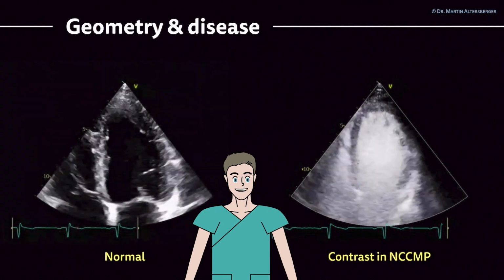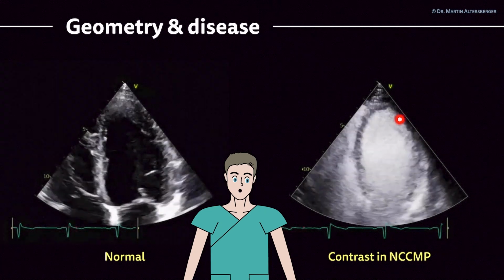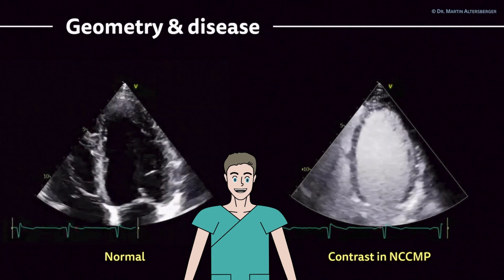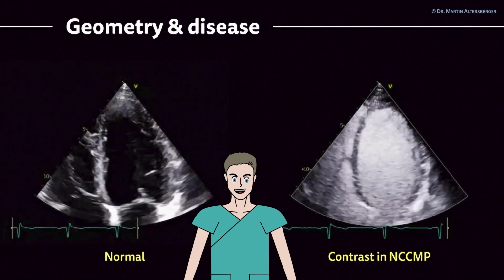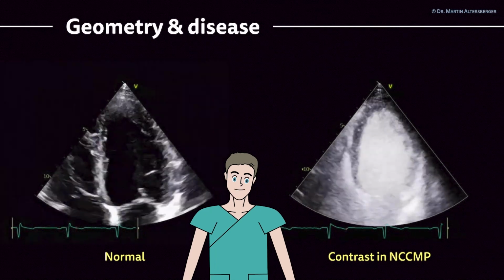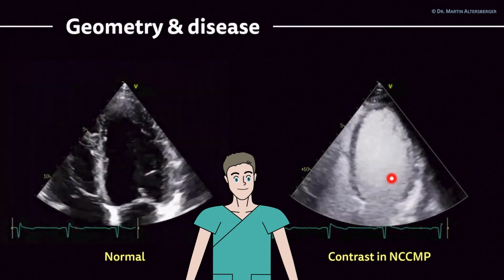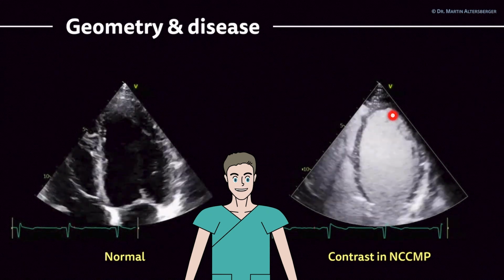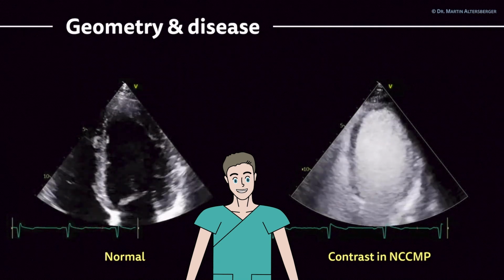45%, and you do see those hypertrabeculations all over the place in the apical and also mid portions to a certain degree of this ventricle. Overall, the ventricle seems comparatively thin compared to this normal example, and you do see that the walls are now dark. So the cavity is filled with the bubbles over here, and that's why you can see those trabeculations, that there are no thrombi present, that it is really an ejection fraction in this range of 45%.